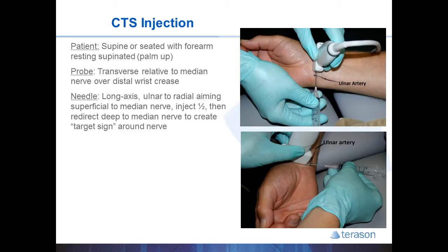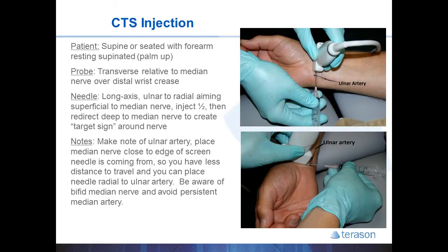You then slide the probe as radial as possible so the median nerve is just under the edge of the probe where the needle will be coming from, so you don't have very far to travel. This should ensure that the needle will enter just radial to the ulnar artery and will help you avoid getting an unintended ABG from the patient. The median nerve is very superficial, so you don't have to travel too far or very deep.